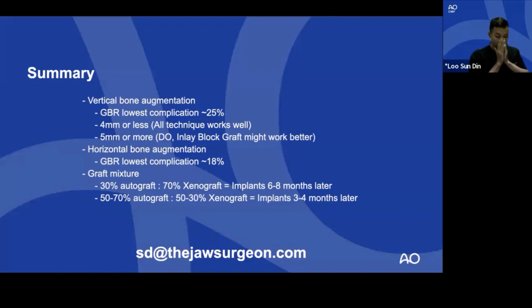Well, extending the flap laterally provides a definite reservoir of bone to harvest. As a result, you definitely get some hematoma there. I'll routinely place a collagen plug or some form of collagen in the palate, and thus far, most, if not all, patients have not really shown any problems or any complaints or increase in pain.